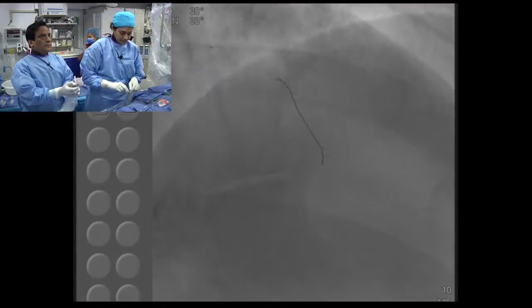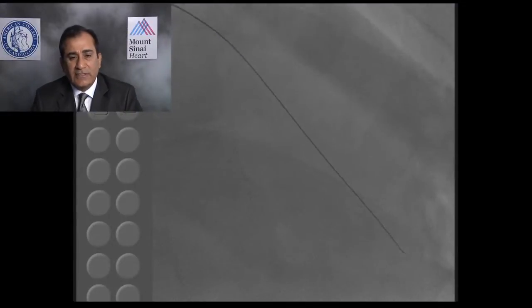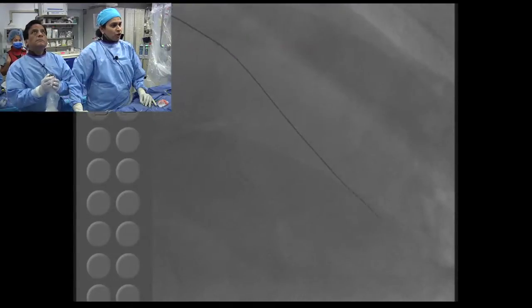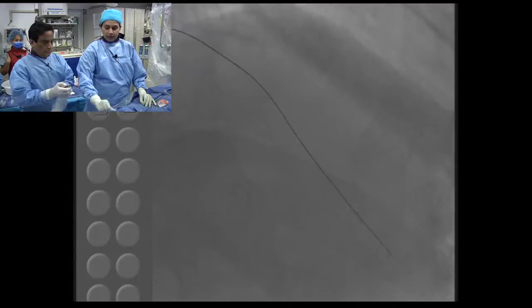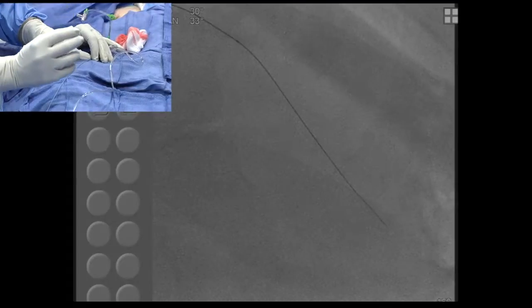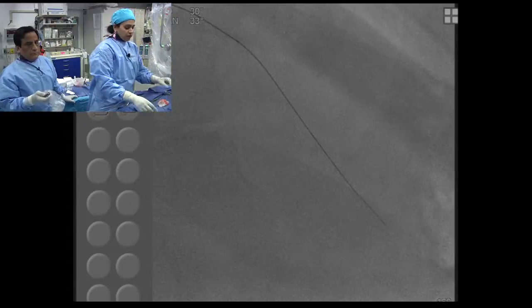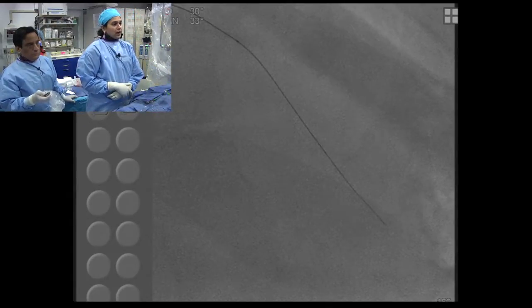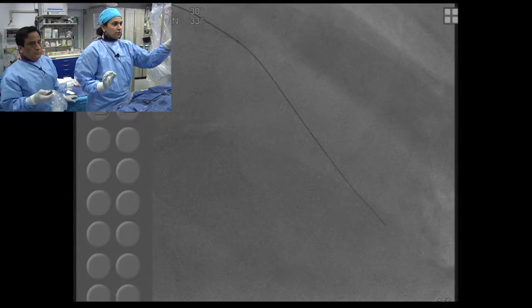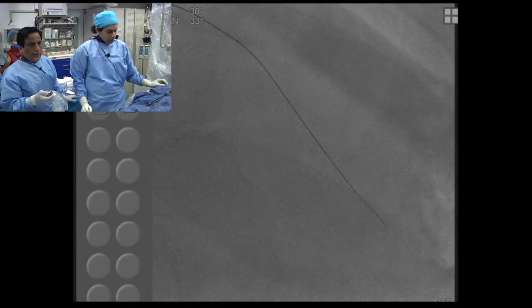So, Sameen, if you go back, this question probably is for Anu. If you go on the wire techniques here, what was this? This was just controlled drilling? Yeah, controlled drilling in the sense that you are not too aggressive, not back and forth like this. My hand movements have to be fine so that if you are subintimal, you don't cause a lot of dissection, or what we call the smoky situation where you are outside the vessel, and even if you are outside, you are still with the wire and have not created some perforation situation.